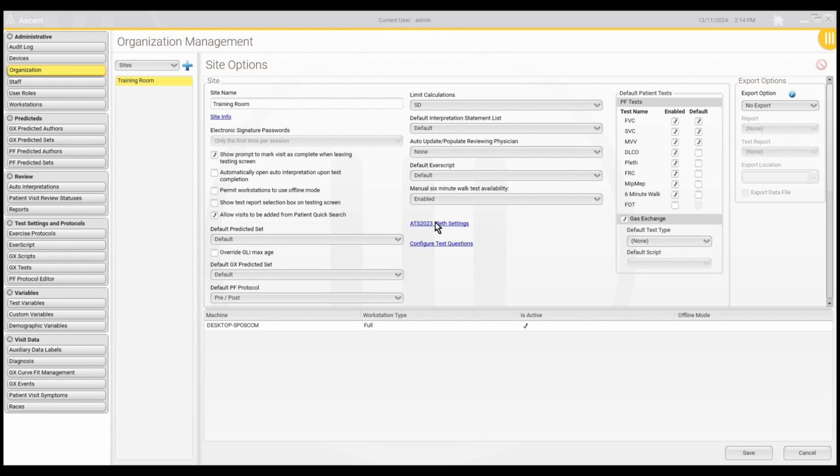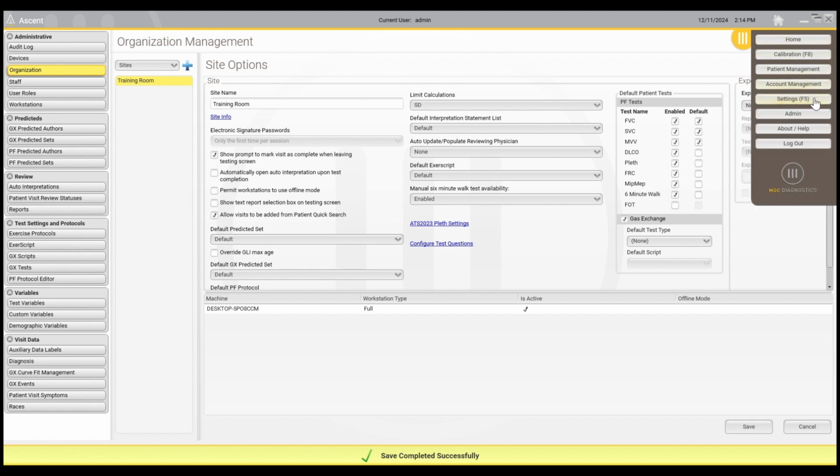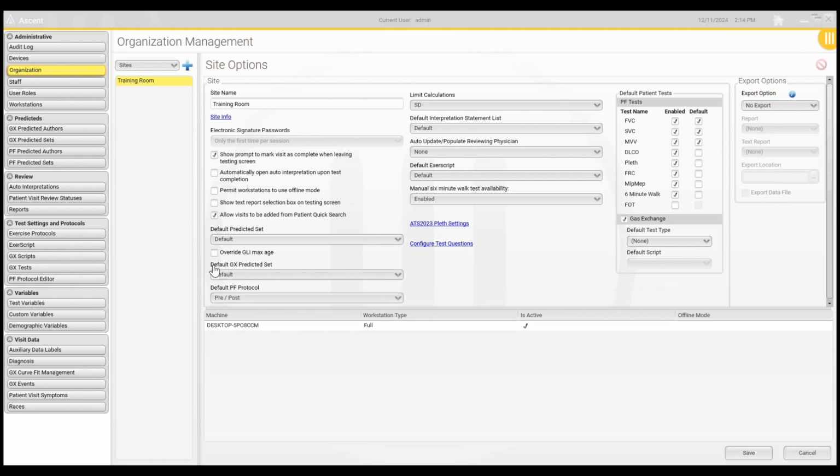If this setting is activated, the following is true in the pleth settings F5. The can perform raw is enabled, but the FRC selection box is disabled, meaning raw efforts cannot contribute to lung volumes. We'll show this in more detail here.